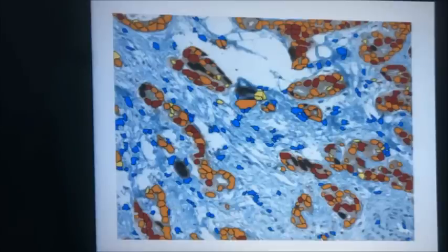This is the same software we have been using. This software failed to count these nuclei. Can you see these? The software failed to count these nuclei, although they are well scanned. So there will always be a need for a pathologist. This is just an example, but there are many other examples.